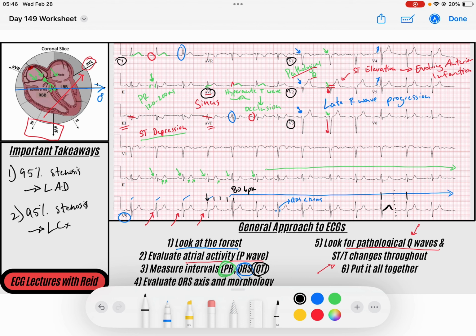So it's a pretty interesting case, right? Where you have a case of multivessel disease causing myocardial infarction kind of at the same time, right? So you wonder maybe what the underlying process was that contributed to this person's acute presentation.